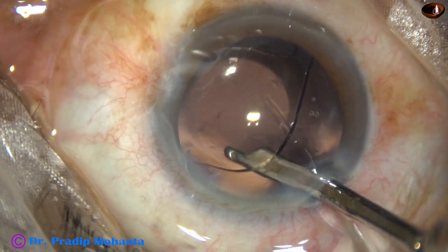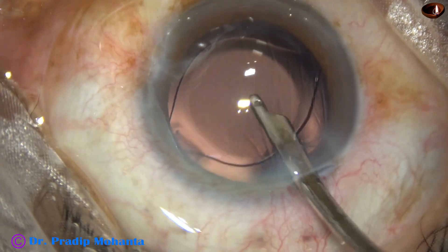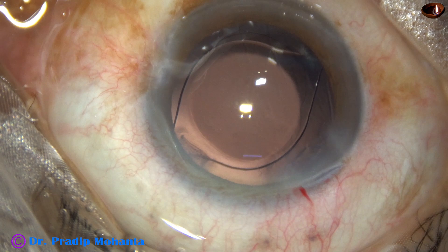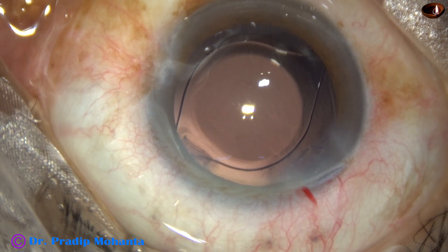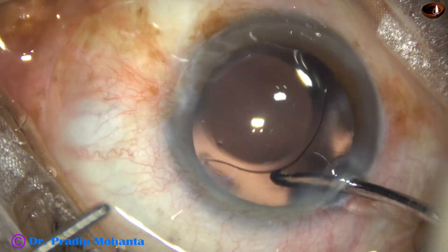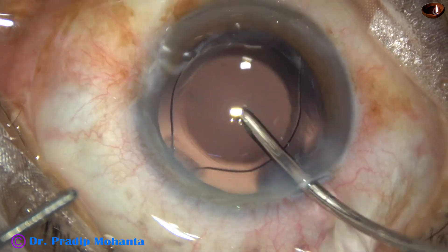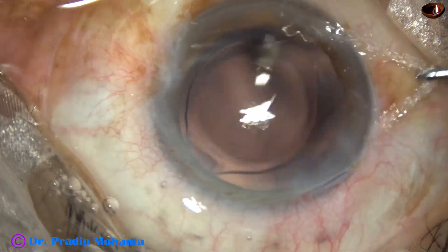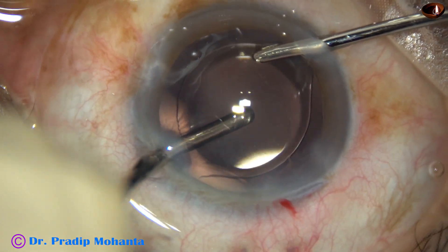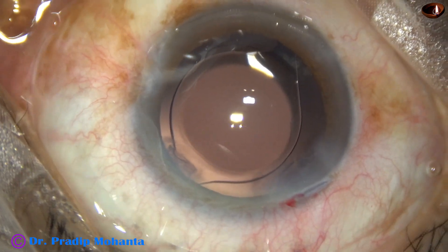With the Simcoe, I am irrigating some BSS in the anterior chamber as well as behind the intraocular lens, and by these maneuvers a lot of visco comes out. Now I take bimanual irrigation aspiration — irrigate the capsular bag, go behind the intraocular lens and irrigate the capsular bag, irrigate the anterior chamber. Using bimanual irrigation aspiration, remove the remaining visco, and it is done nicely.